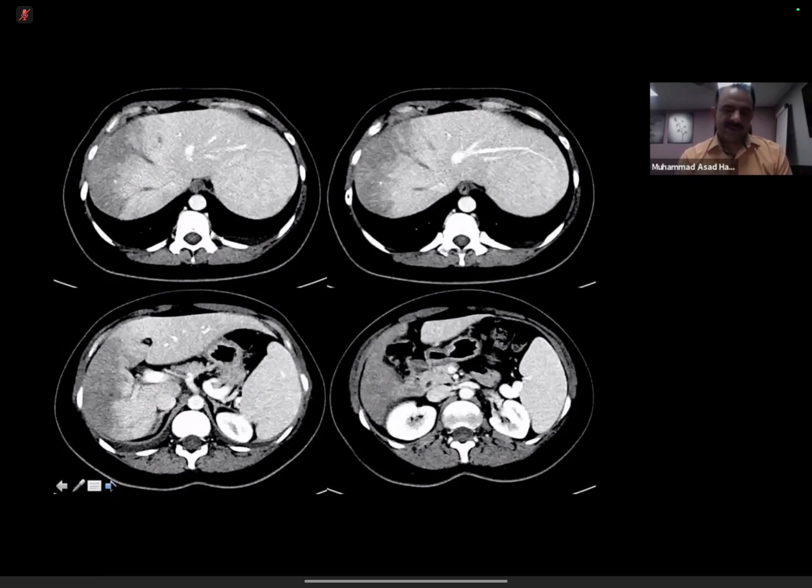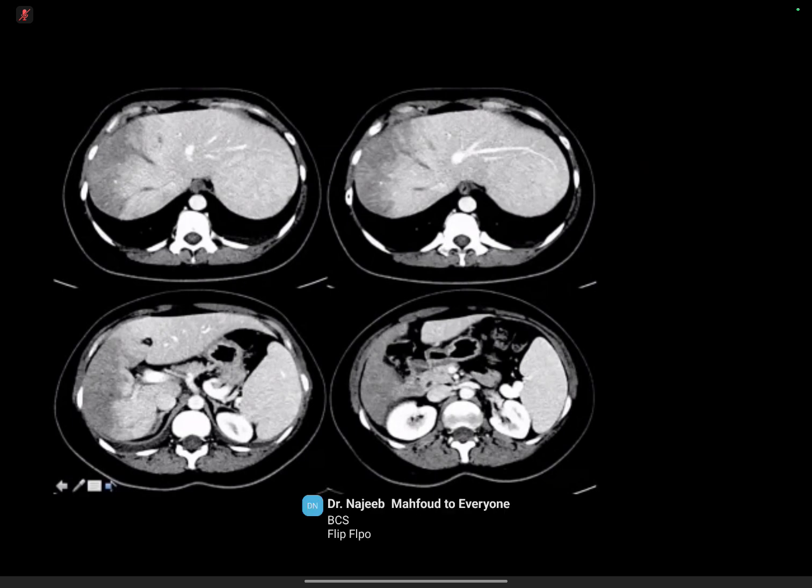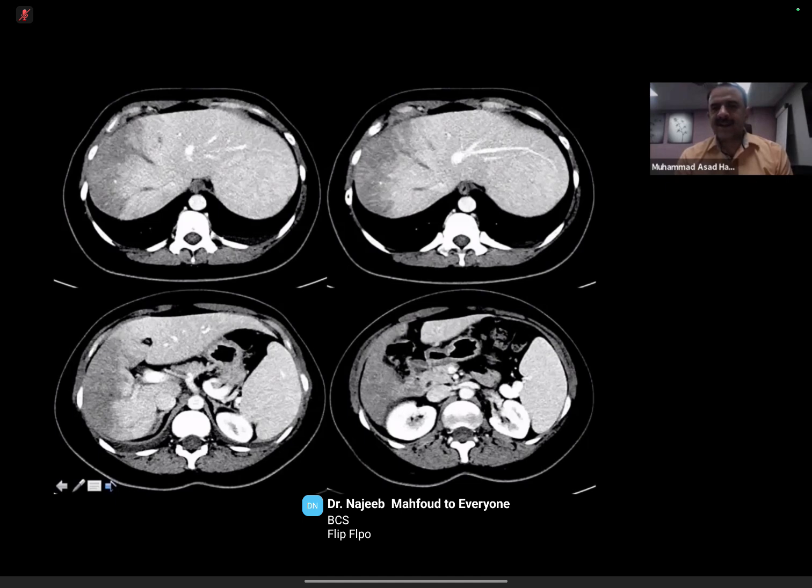So you have described that one hepatic vein has some thrombosis, is not visualized. That is leading to the altered enhancement of the right lobe of the liver. What's your diagnosis? Since the rest of the liver appears normal, I wouldn't call it Budd-Chiari. Well, I mean, it is Budd-Chiari. Budd-Chiari can happen with the selective. Okay. Sure. So that is your diagnosis.